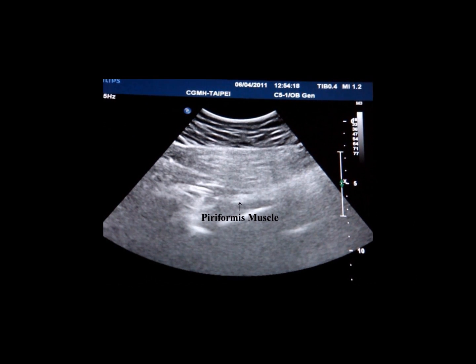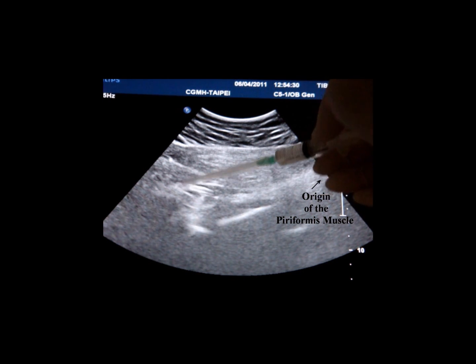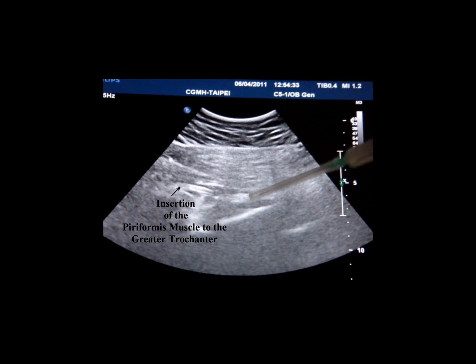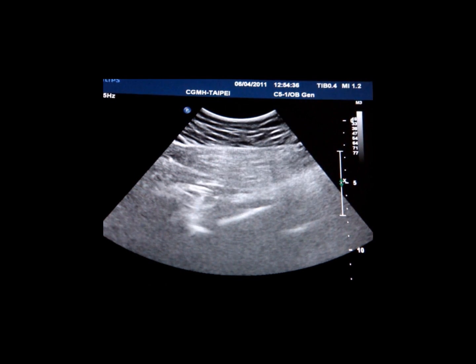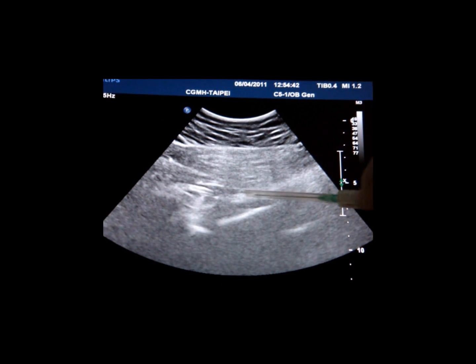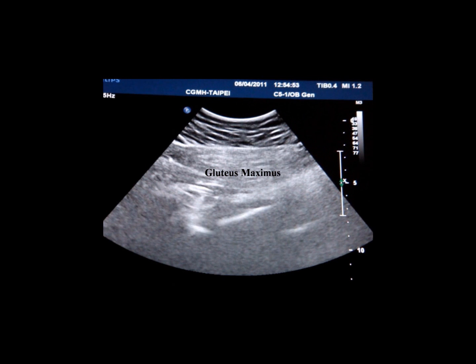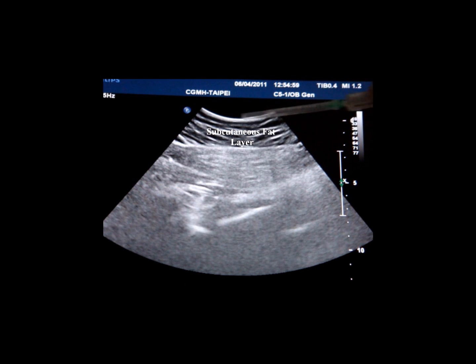In the anatomy of the piriformis muscle, it originates from the anterior side of the sacrum and inserts into the upper border of the greater trochanter of the femoral bone. This hyperechoic band-like structure is the piriformis muscle. This muscle bulk over here is the gluteus maximus muscle, and here is the subcutaneous layer.